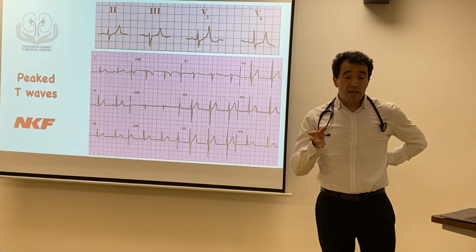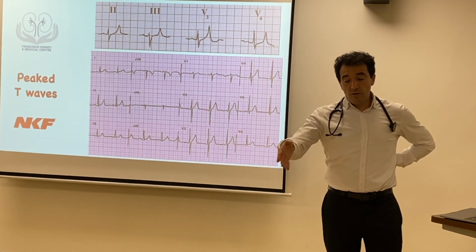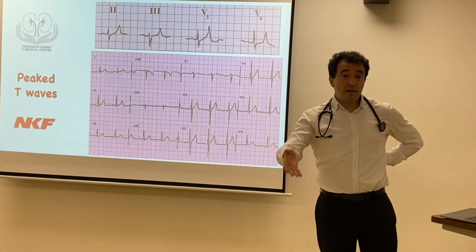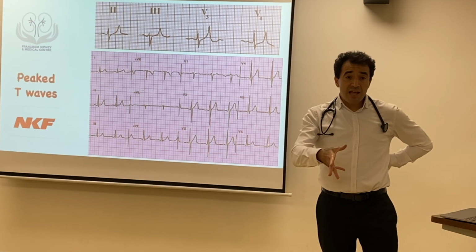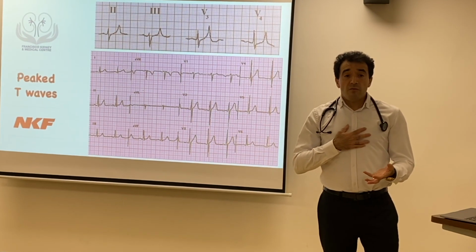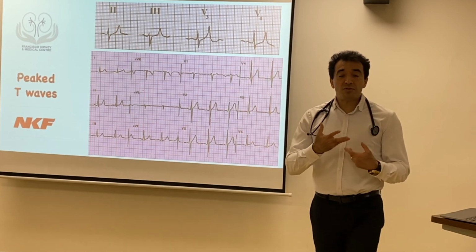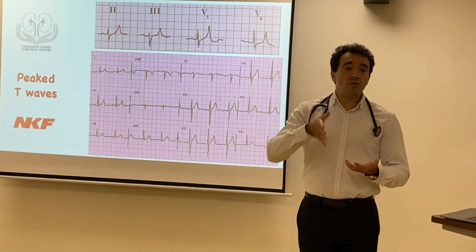For pacemakers, there are different types: atrial, ventricular or dual, and they can sense or fire, they can be on demand. Some, for people who exercise, can sense when the person starts having more activity and then trigger a faster heart rate.